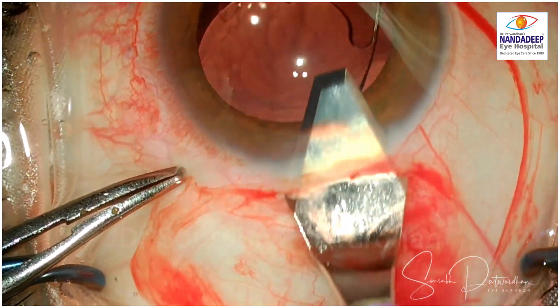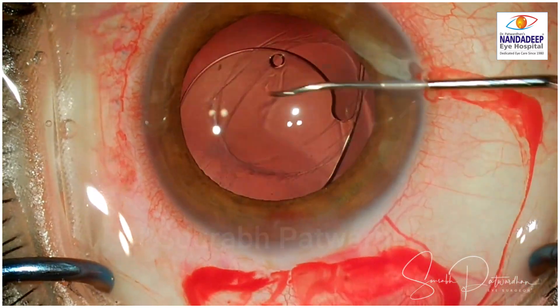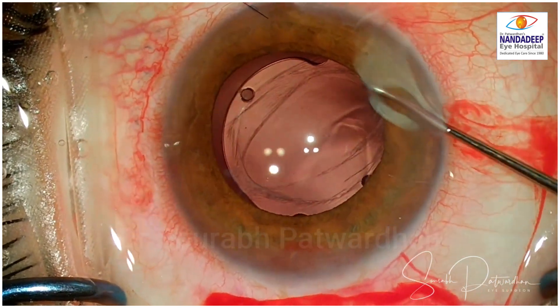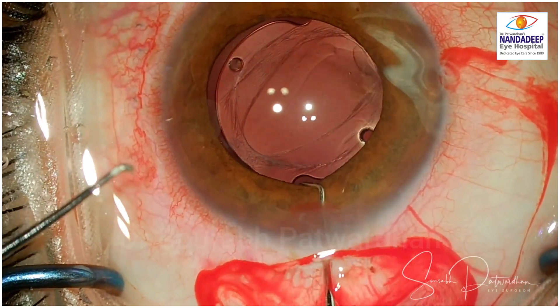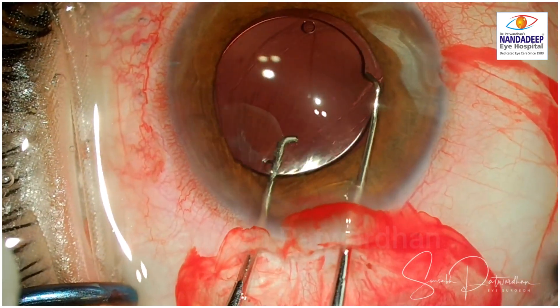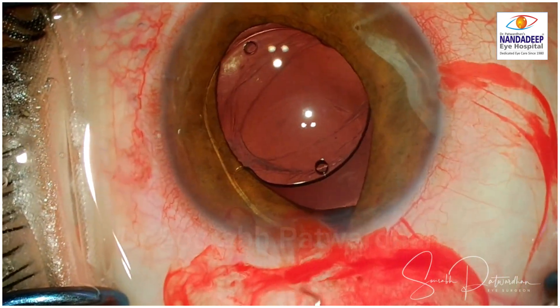I enlarged the scleral incision to 6mm and I am now going to rotate this IOL into the anterior chamber. The anterior vitrectomy has been done properly, so you can see there is no vitreous. I was checking after rotation of the IOL whether it centers — and it was centering alright. But I have to exchange this because of the refractive surprise as well, though redialing the IOL is also another option. The patient was quite worried about the glares, so I don't want to take another chance.